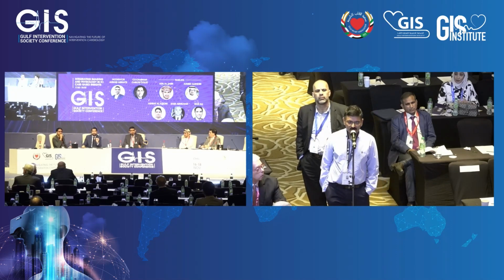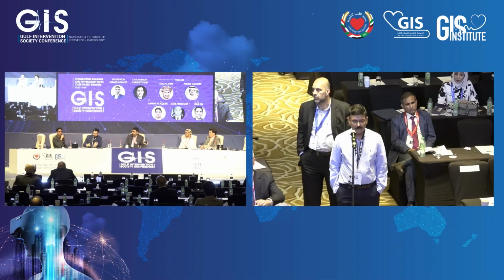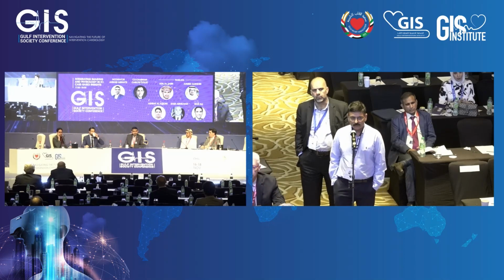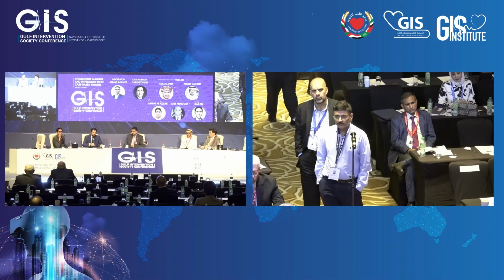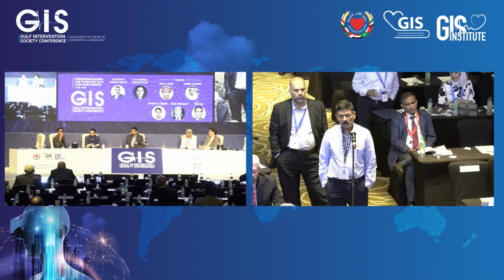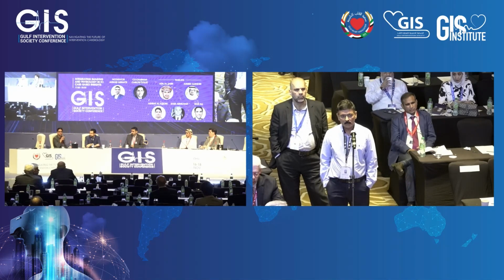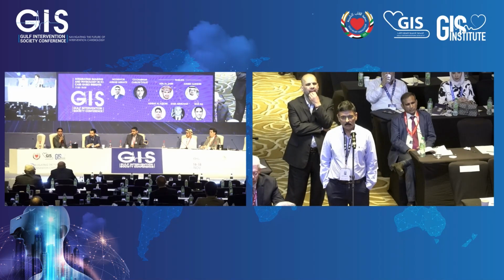So you're saying the key is PPG. PPG is the most important. Yeah, and I think Carlos will show you on a few slides later on exactly what the PPG looks like and what it means, so that you can all have a greater understanding. In my opinion, this metric is going to become as important as FFR or iFR cutoff values. Because ultimately, we're looking for a decision to treat in order to benefit patients. And we've seen the data for FFR, we know the data for iFR, but we're missing this diffuse disease algorithm. And now that we have PPG, we'll be able to make a clinical decision as to whether or not patients will benefit from PCI based on whether it's diffuse or focal.